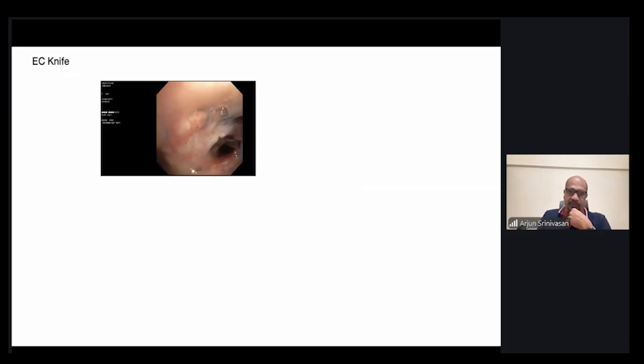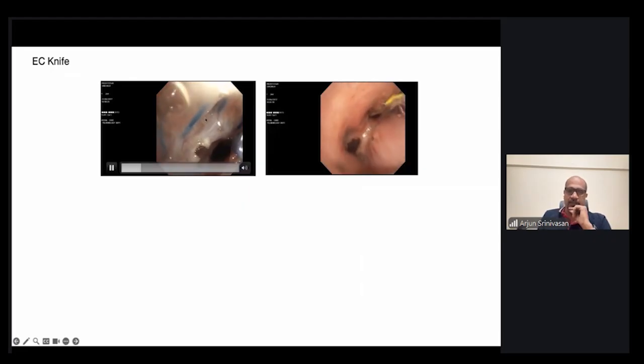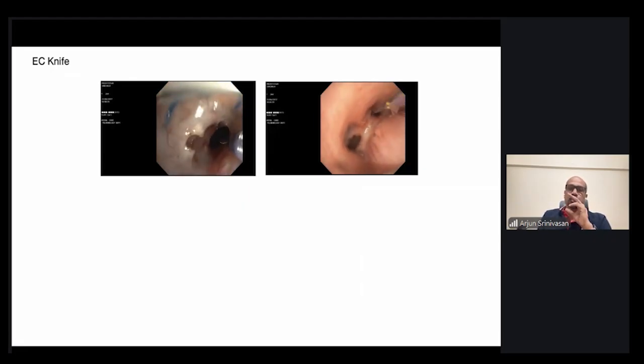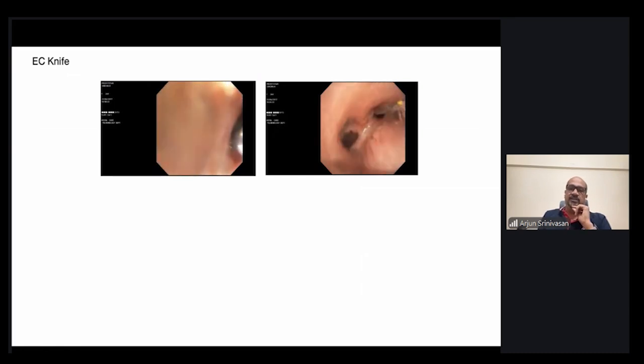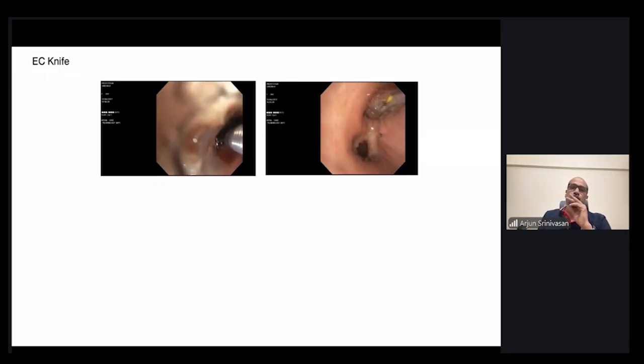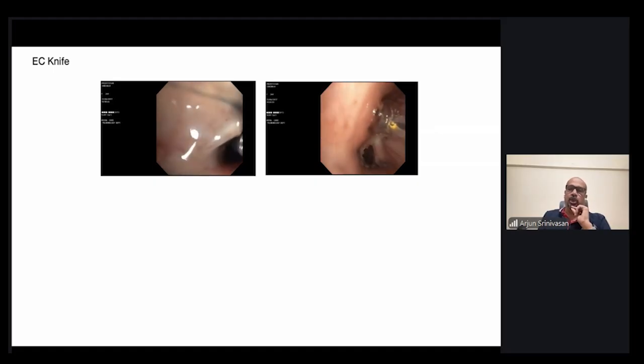This is a post-transplant patient, with bilateral webs you can see. And when you're using this, you have to again make sure that the entire knife is out. And this has to be followed with a balloon dilatation. You can see the suture line there. Whenever you're using a knife, you have to make sure that the knife is out, the FiO2 is down, and you always do only the anterior or the lateral wall, and it cuts and it has to be a very short burst.